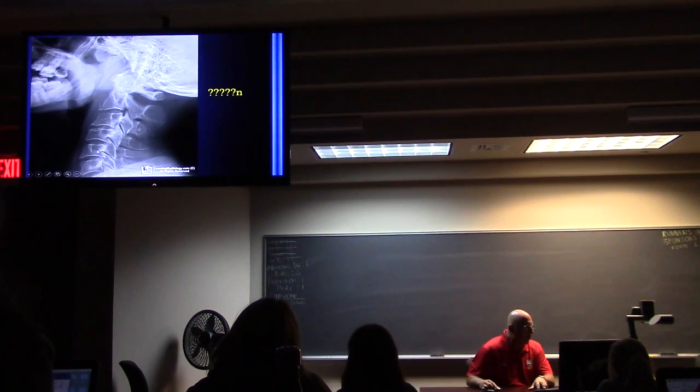Two, three, four, five, six, you don't see 7. Anterior vertebral line, posterior vertebral line, spinal laminar line. Look at the soft tissue at 2. From here to here, that is bigger than an intervertebral disc space. And you see why? See the fracture at the tip of C2? So the soft tissue is a reflection of that.